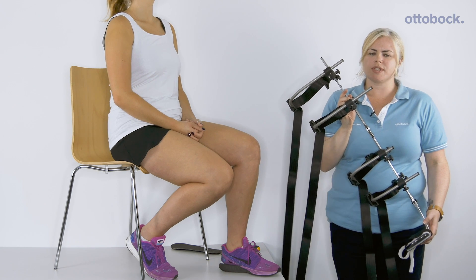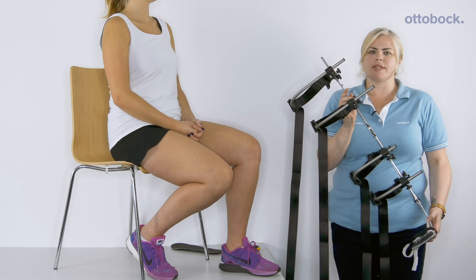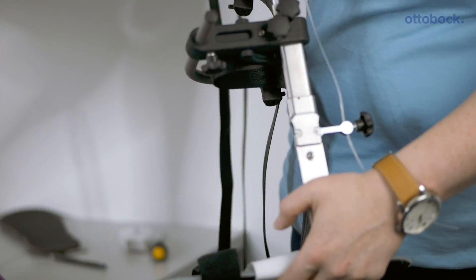This is the Free Walk Dynamic Test Orthosis. It can be sent out to clinic to test if it is suitable for the patient. It's a stance control, so it will lock in stance and unlock for swing.